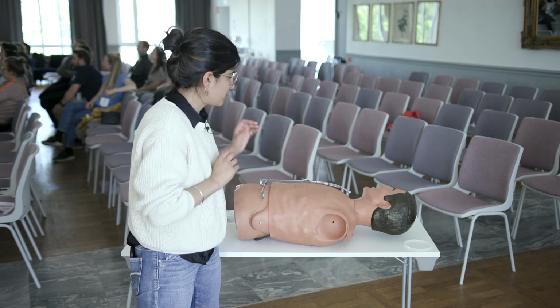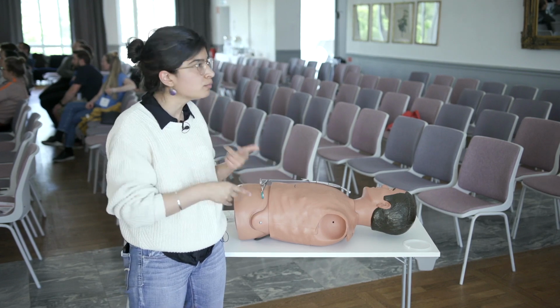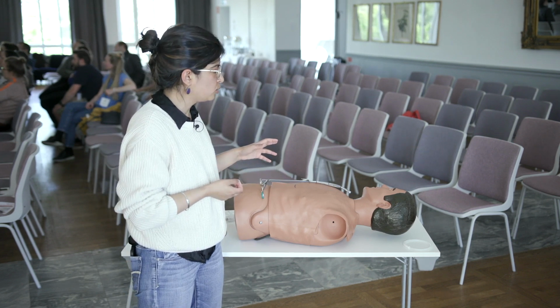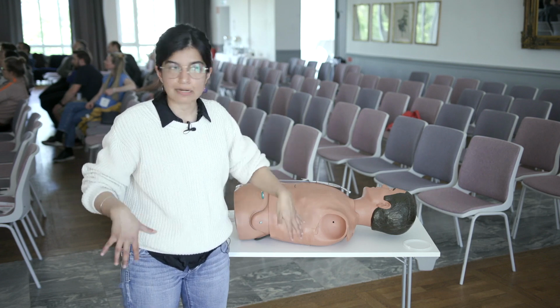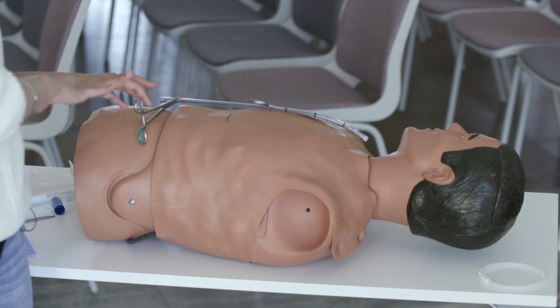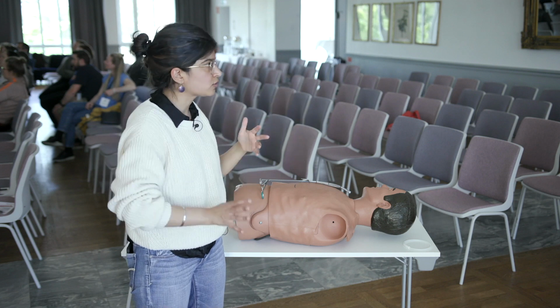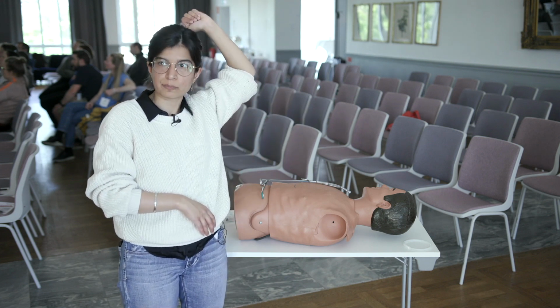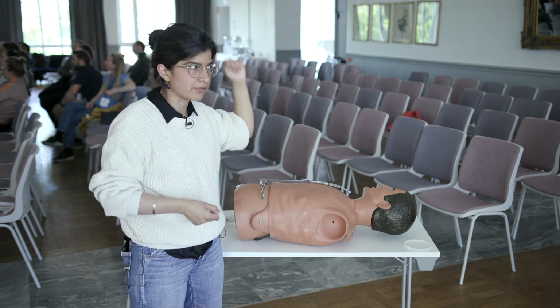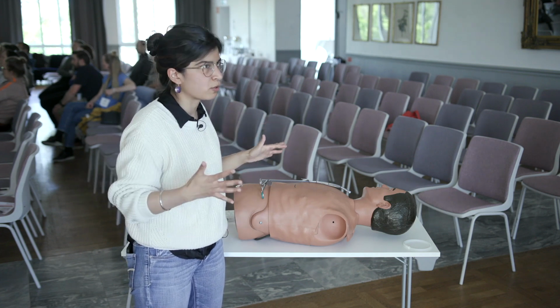Okay, so chest tubes. This is your patient that's come in with a pneumo or a hemothorax and you have to evacuate the pleura. You always want to gown up sterilely. If your patient is lying supine like he is, make sure the arm is up. Depending on how fast you're going to do this, it can get really uncomfortable for a patient to hold their arm up themselves, so you may want to tape it down or put a tie around their arm. So you gown up, gloves, full sterile precautions.